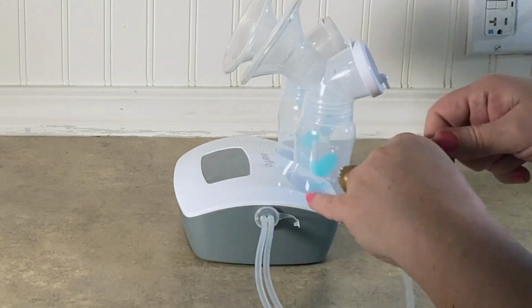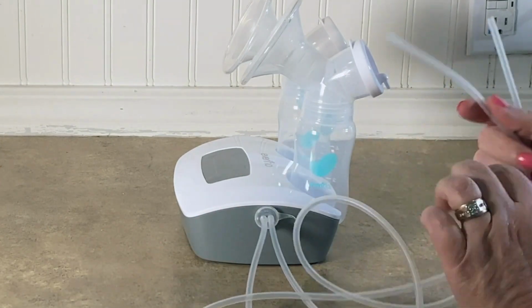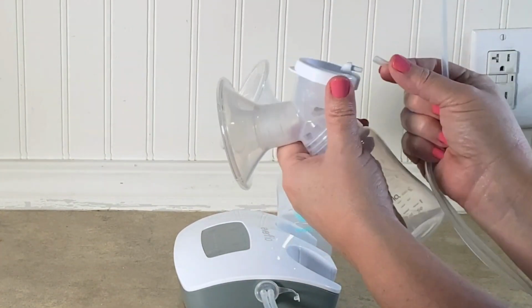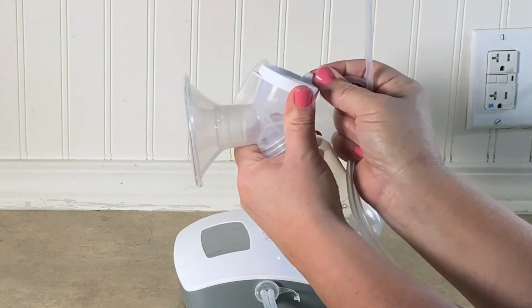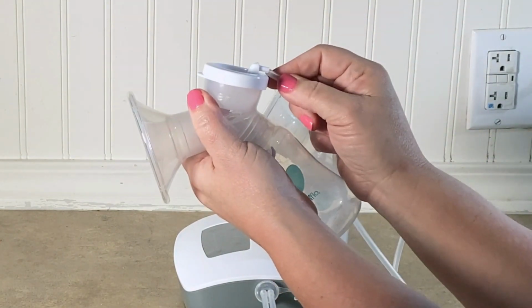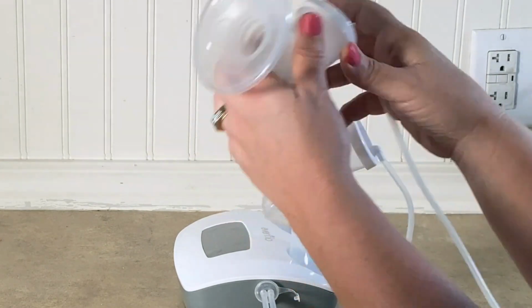All right, now let's go to the other end of our tubes. To attach it to the collection bottle, we're just going to press it over this little edge. And you want to press it all the way as close to the diaphragm cap as possible. And we'll do that with both pumps. So this is set up for double pumping.